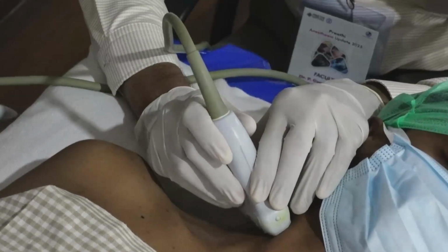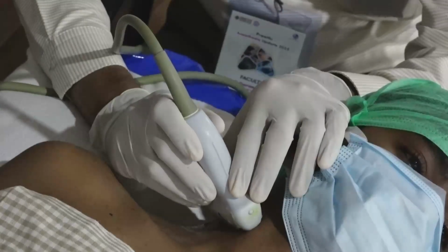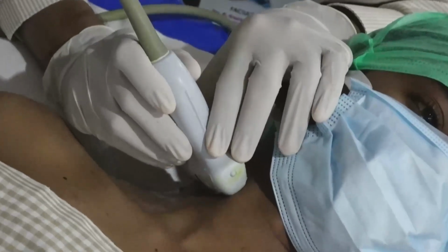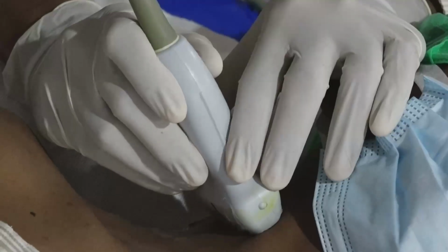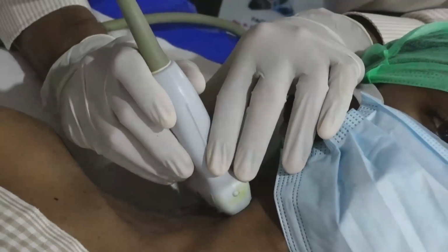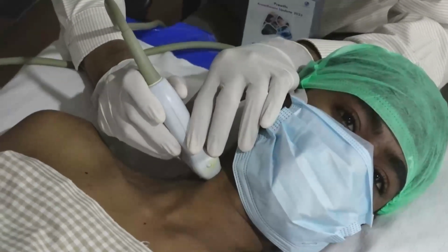Then if we move the probe even more cranially, again we can see one component coming and going out. That nerve component is C5. Here if you see the anterior tubercle and posterior tubercle, they are almost equal in size, which is the usual differentiating feature between C5 and C6.